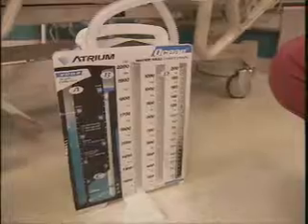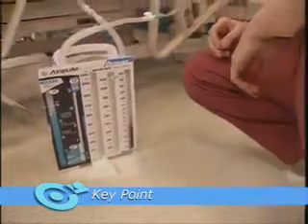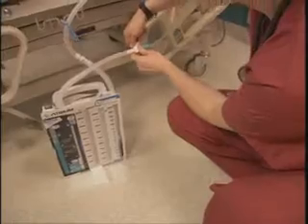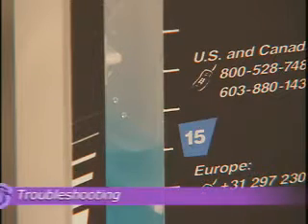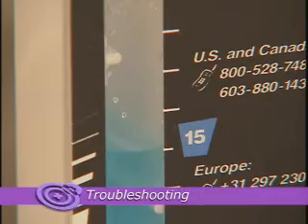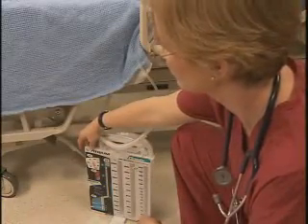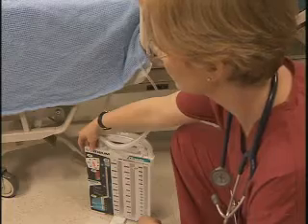Next, check the suction control chamber. For a patient receiving wet suction, assess the chamber's water level by briefly stopping the suction to halt the bubbling. Then inspect the water level, which should be at the prescribed amount, such as -20 centimeters. If the water has evaporated and its level is low, add enough water to reach the amount ordered. For a patient receiving dry suction, make sure the suction control regulator is set at the prescribed amount.